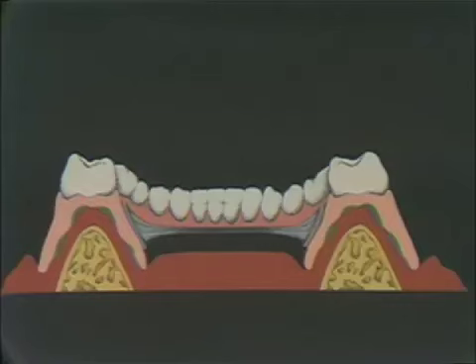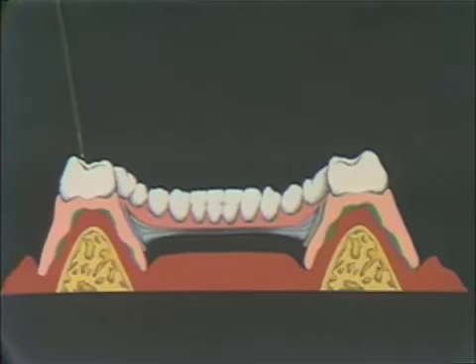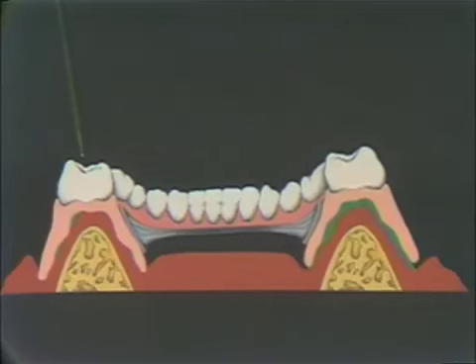With this graphic, we can explain why we would get movement of a base. If we distorted the tissue during the impression procedure, or we did not get the detail, we would have a base that would look somewhat like this. It would not fit the tissue at rest. When the base is at rest, the tissues have rebound and the base sits on the tops of the tissues. Now, when a load is applied to this side, this base would go towards the bone and the tissue until it reached a stable position.